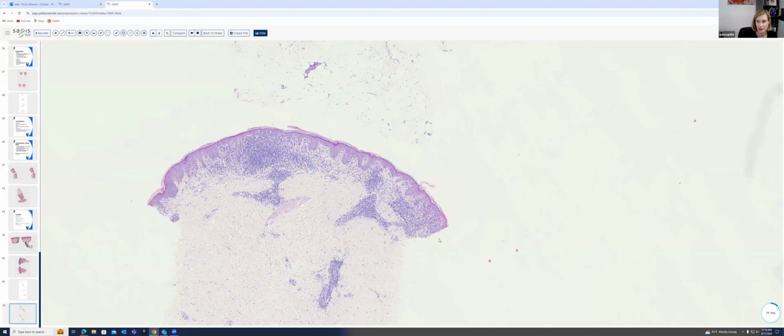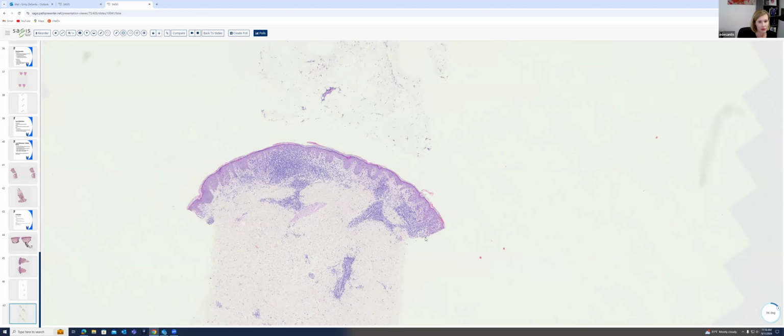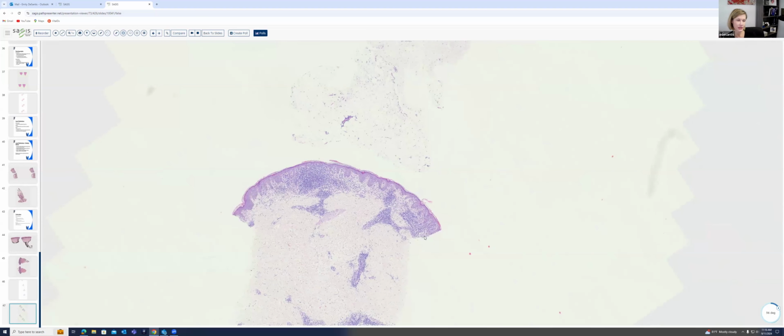So that is our last slide for this talk. We are going to follow this up with some discussions of pustular and granulomatous dermatitis and also vesiculobullous dermatitis. And then following that, I will prepare some unknown slides that we can go through and discuss that will include examples of many of these different inflammatory entities.